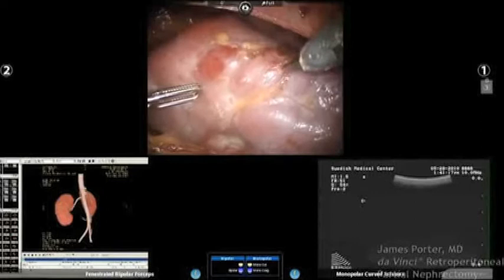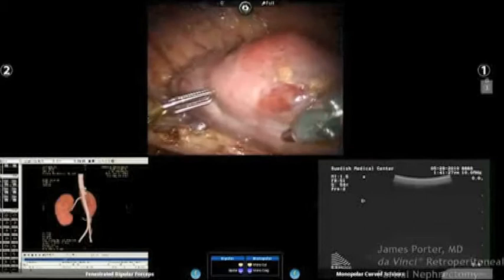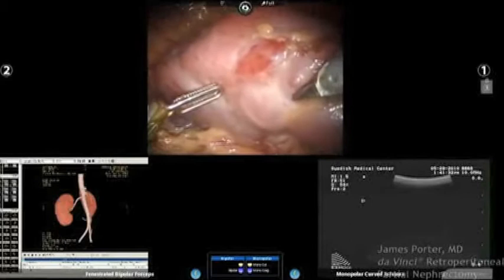I'm going to have to be this low probably to get this tumor out. The tumor is right here, and it actually extends this way. So I'm going to be coming like this. So we can excise that out if you're out. It doesn't look cystic on the ultrasound. Just do it again, Nance.